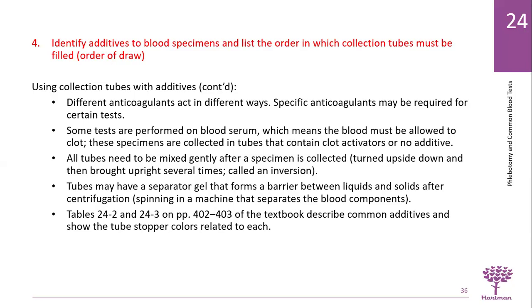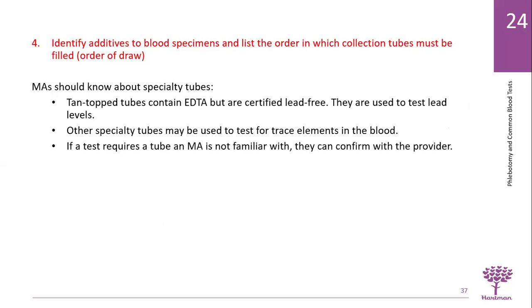You should have pictures of all of this in your textbook. Your tan top tubes contain EDTA but are certified lead-free. They are used to test lead levels. Other specialty tubes may be used to test for trace elements in the blood, but if a test requires a tube the medical assistant or phlebotomist is not familiar with, you can confirm it with your provider.